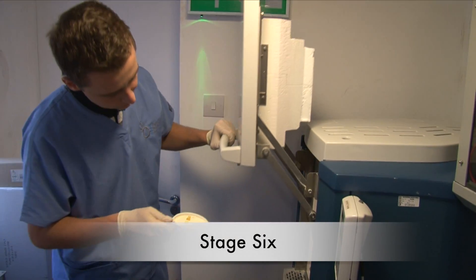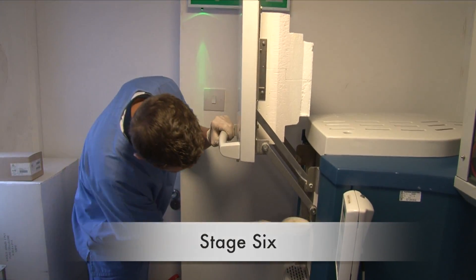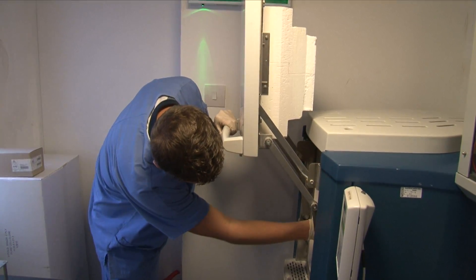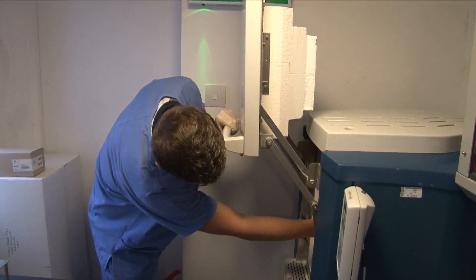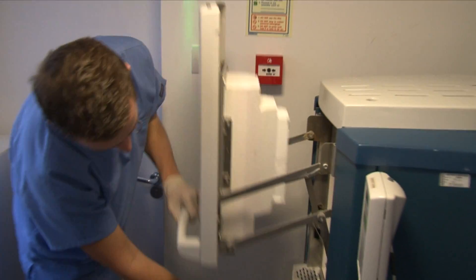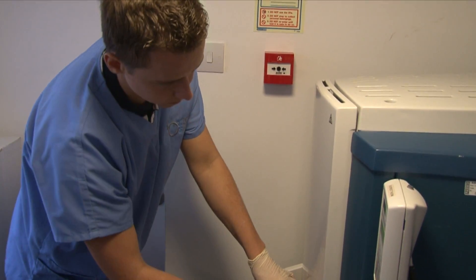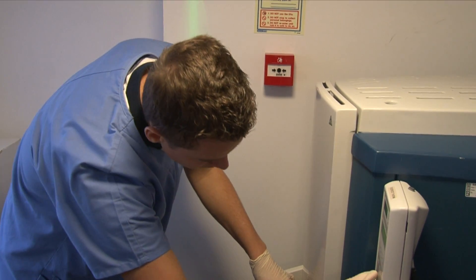The dental technician will then put the prepared framework or final restoration in the furnace for the sintering process at high temperature, around 1500 to 1600 degrees, which reduces the porosity and enhances properties such as strength, electrical conductivity, translucency and thermal conductivity.